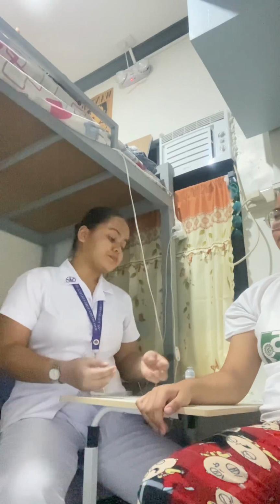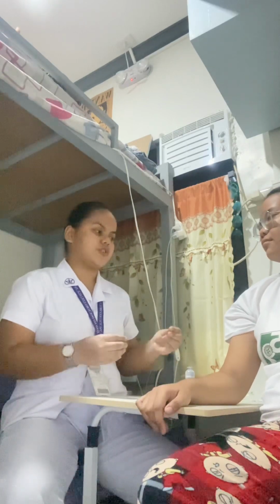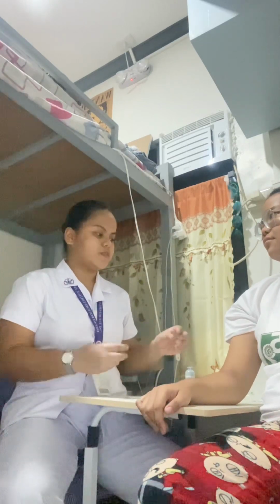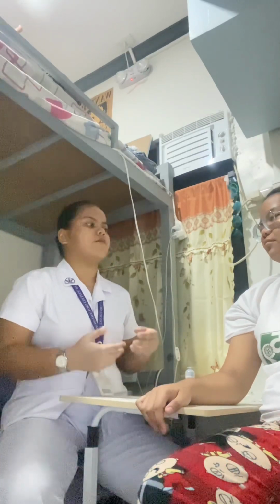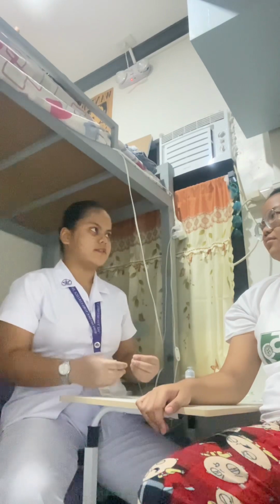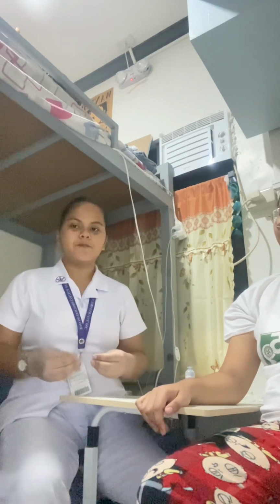So this injection, the medication I'm going to administer to you, is prescribed by your physician. This is to lead you into a fast recovery and to treat your illness. Explaining the procedure to the client will help to facilitate acceptance and reduce the anxiety they might be feeling. Then after that, I'm going to select and locate an appropriate site.